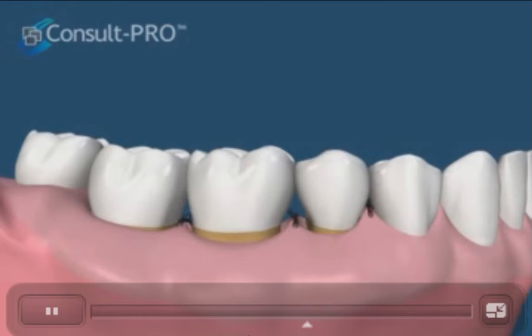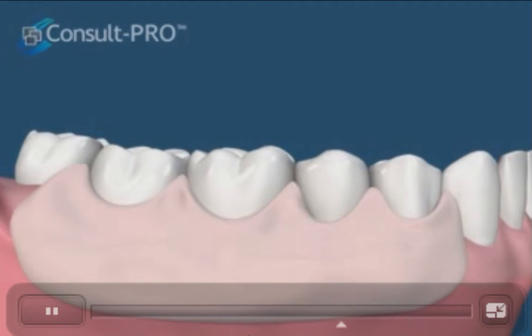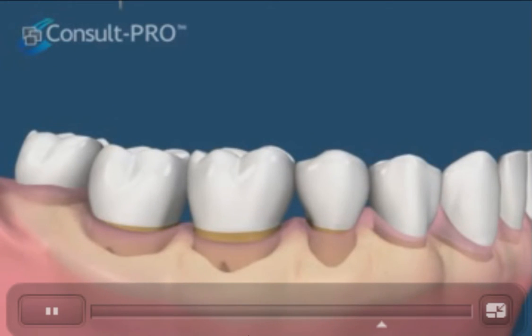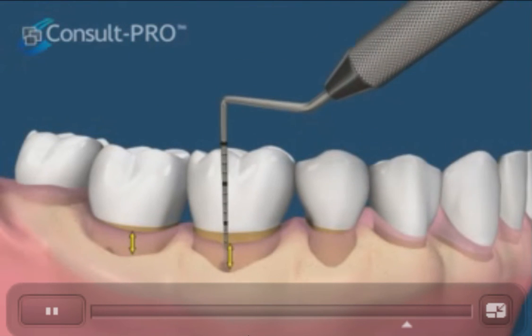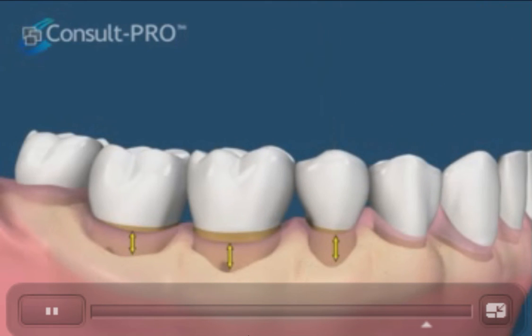Then a periodontal dressing may or may not be placed to help with healing for a period of time. The sutures are removed, or dissolved if resorbable sutures are used. Now we can see that the periodontal measurements demonstrate much shallower recordings. We can also notice that we now see the hidden recession because the gums now follow the receded bone.